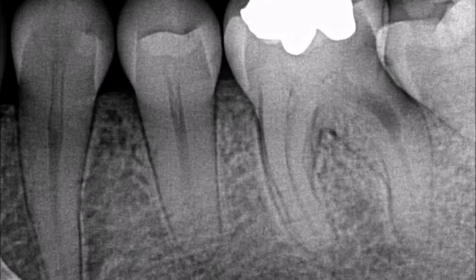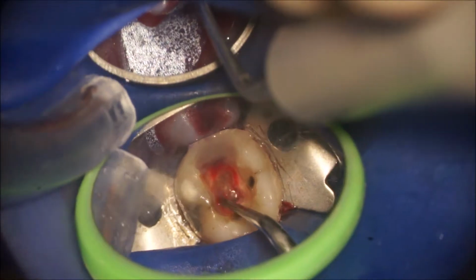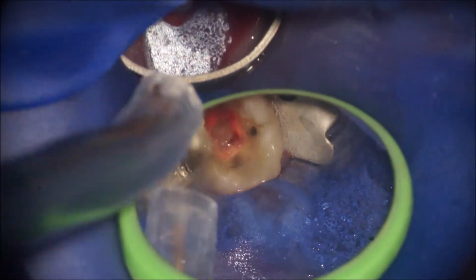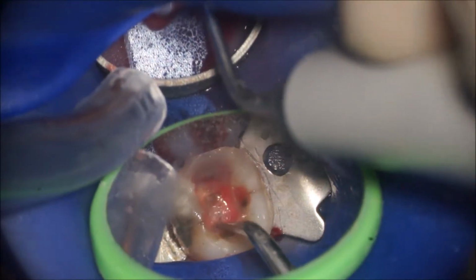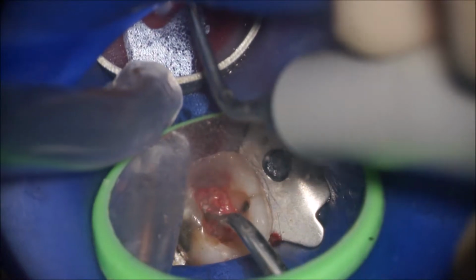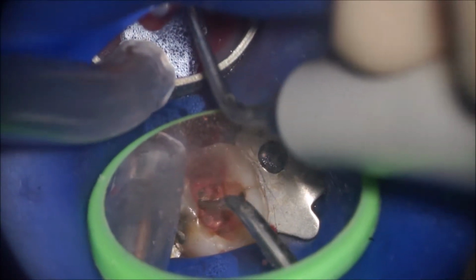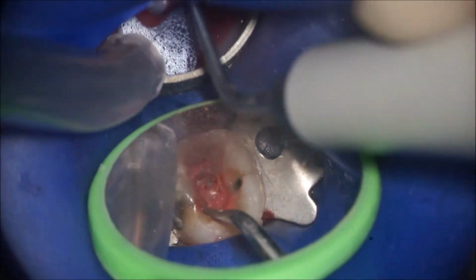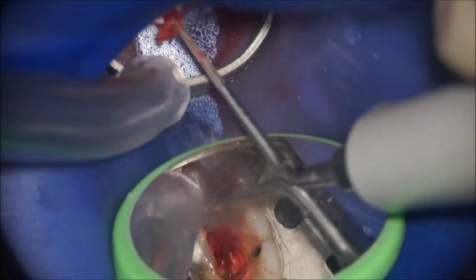Something I didn't mention on the pre-op is the calcification, reactive dentin in the pulp chamber. De-roofing the pulp chamber revealed a firmly attached denticle. I prefer to use ultrasonics to remove them if I have time. If I don't, it's a fast diamond that you have to be very careful with. It's always a nice moment when it comes out, like in this case, in a single piece.